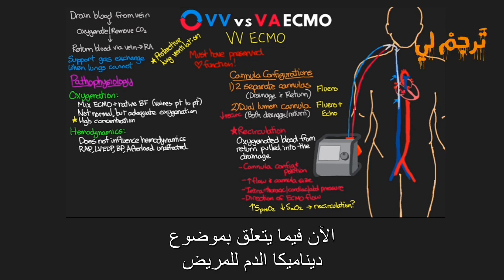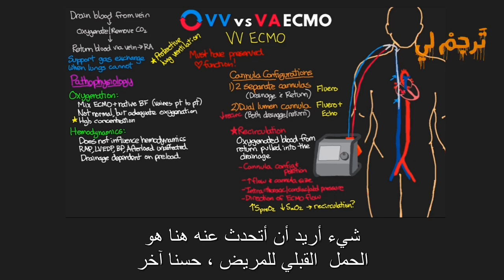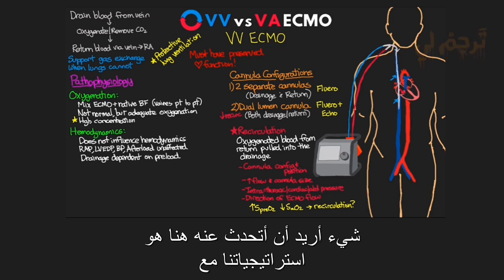Now that said, on the subject of hemodynamics, the drainage of this system is going to be dependent on our patient's preload. All right, and the last thing that I want to talk about here is actually our strategies with anticoagulation.